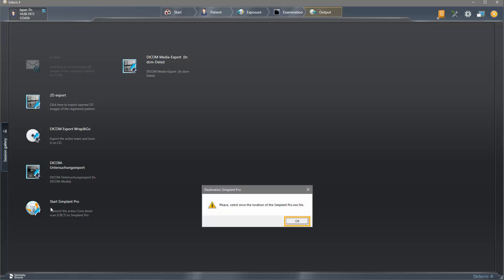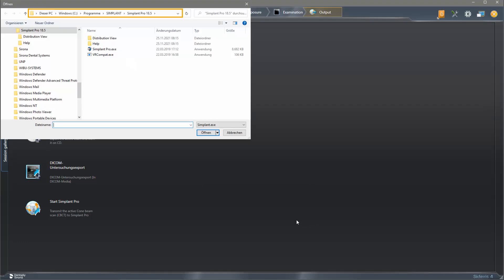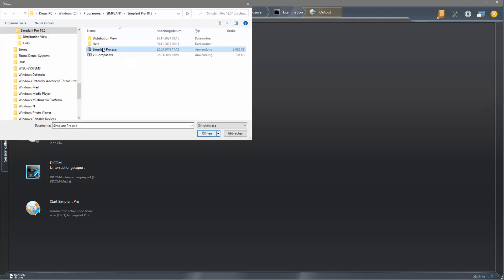We confirm with OK and the drive where the Simplant.exe file is saved opens. We select the file and confirm with Open.